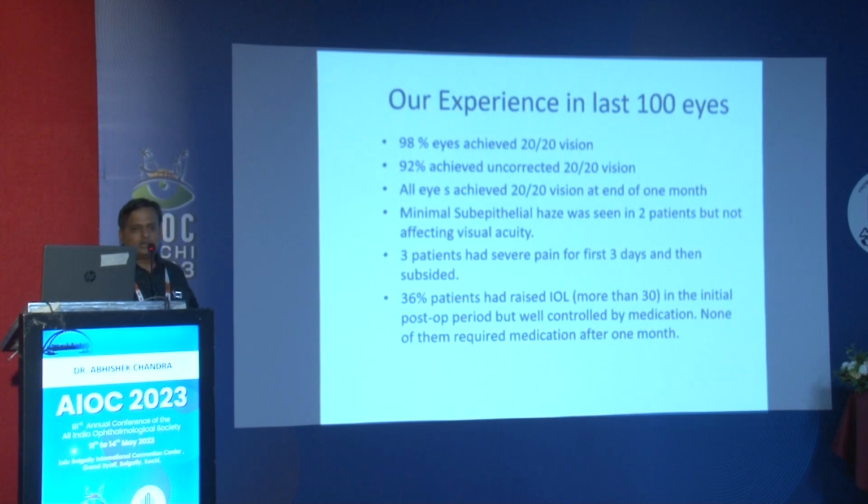And there's one thing which I wanted to have the opinion of the audience. In my study, what I found is that 36% of the patients had a high IOP in the initial period, more than 30 or even more than 40, whereas steroid responders are usually 8 to 10%. But in my study, I found that it was really high, maybe because the epithelium is not there and there is an increase in the drug penetration of Predfort. I'm using Predfort. Many people use Elpred. But in this study, what I found was that the pressure was relatively higher.